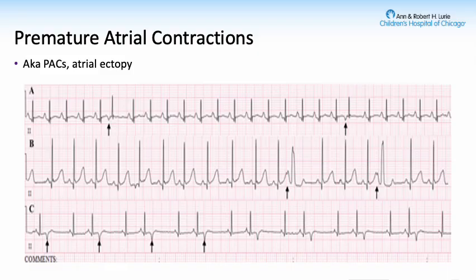So we'll talk about ectopy for a second, and then we'll delve back into those tachycardias because everything starts with ectopy. So PACs are the thing that you all are probably most familiar with. This is such a common phenomenon in the newborn period and in the NICU. You can have normal premature atrial contraction, so normal sinus beat, abnormal beat with an abnormal P wave morphology.